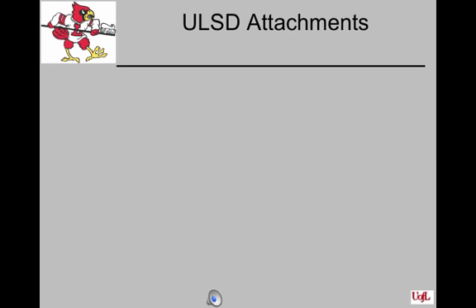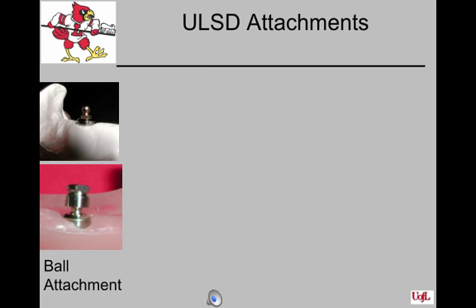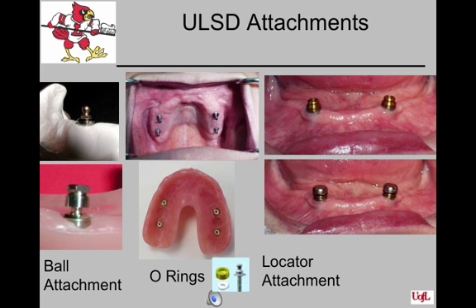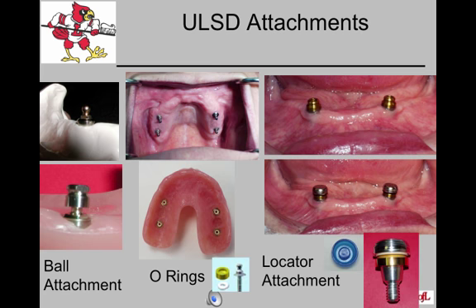These are the three most common attachments that we have used around the ULSD in recent years. They are the Noble Biocare ball attachment, O-rings, and the locator attachment. We are using the locator now in our 2 implant retained complete denture cases and in our RPD implant reconstructions.